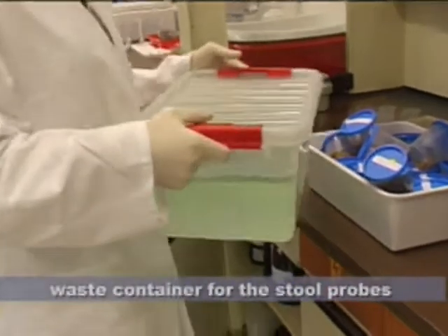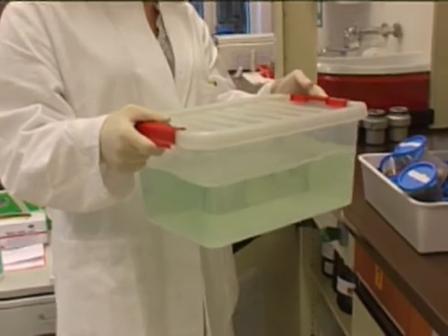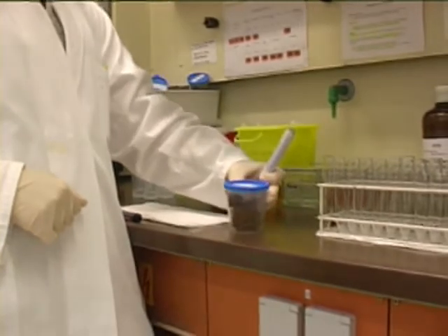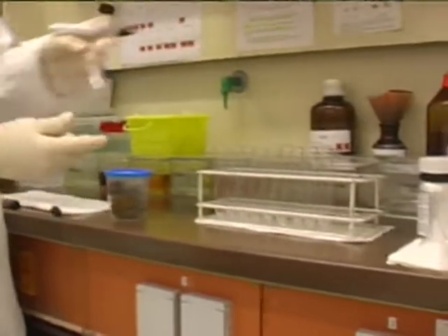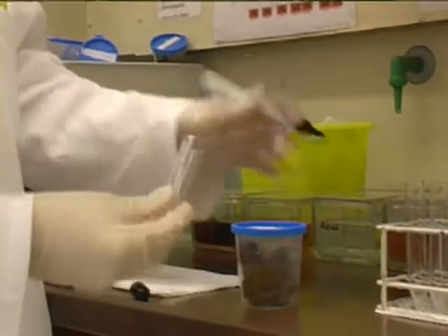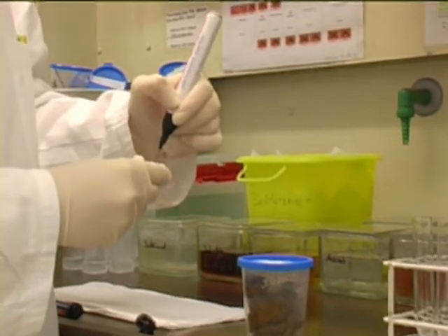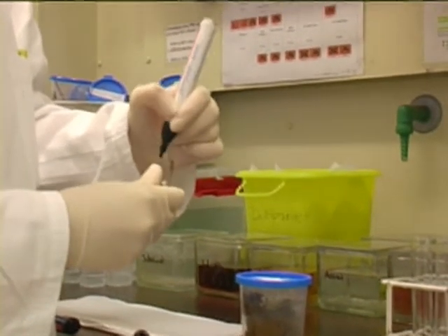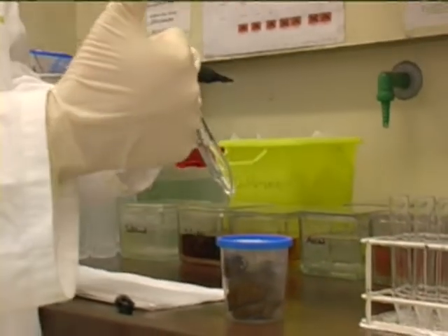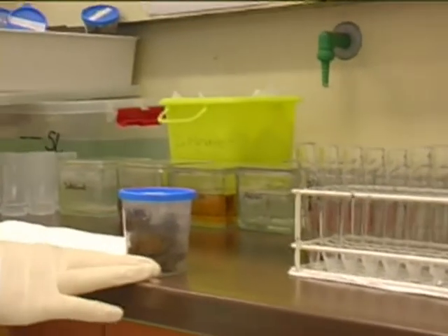Okay. This is the waste container for disinfecting all the rest of the stool sample and anything else. First step is the patient. You give the tube the name. I don't want to have the name, but obviously we're labeling the tubes first. How many tubes? One glass tube for one stool.